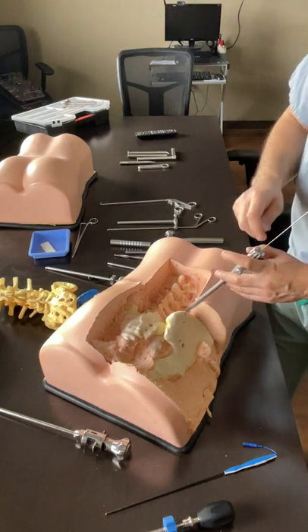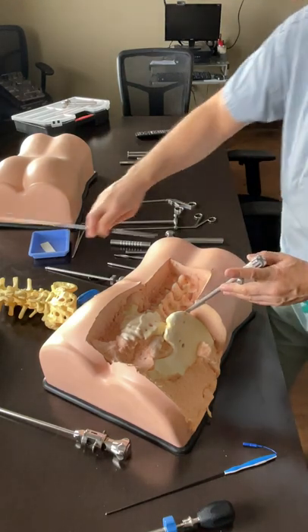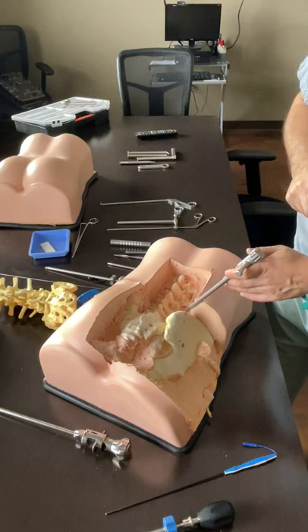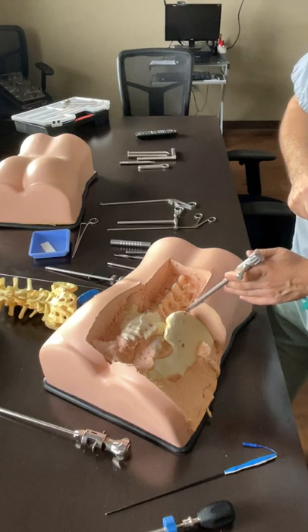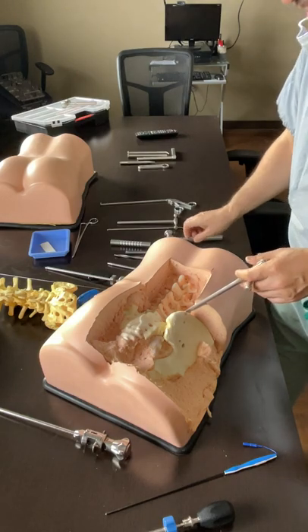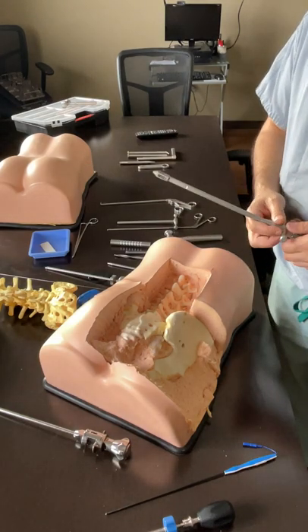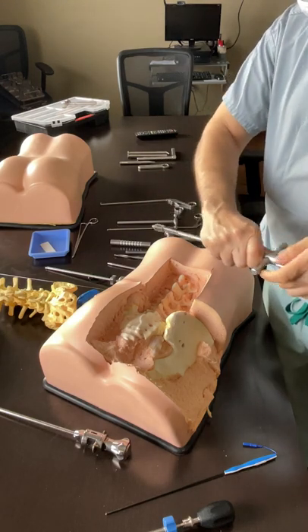Once you put it in - once you dig it in - take the big hammer and ram it in. Once half of the cage is in, the K-wire can come out, and then you do final positioning. Once half is in, you can somewhat change the angle and put it more in the front or to the other side. I sometimes put it eccentric on one side to correct for scoliosis, and then you literally disconnect it.